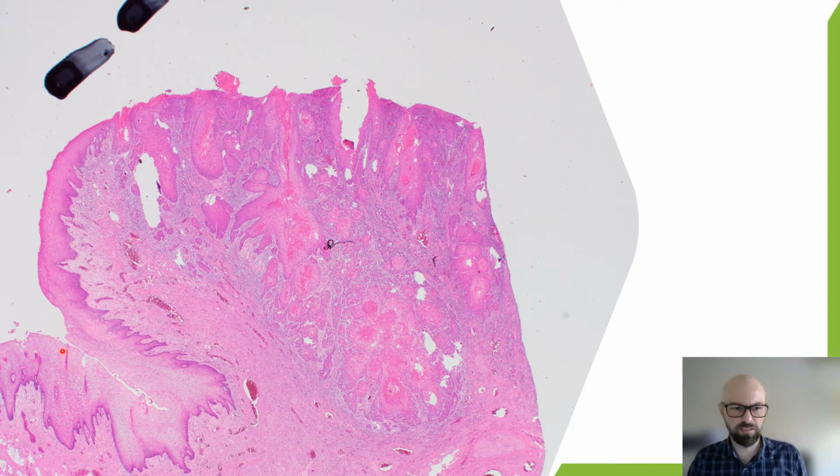So in current recommendations, what you would do is measure across here where the basement membrane would lie, and then take a depth of invasion from that. This slide also illustrates one of the common issues with taking depth of invasion measurements, in that most tumours are really quite large and you can't fit them in a single slide. You can only get about 2 centimetres on a slide. So getting normal mucosa on either side of a tumour is really not possible. So drawing in where that basement membrane would most likely sit is the best recommendation at the moment.